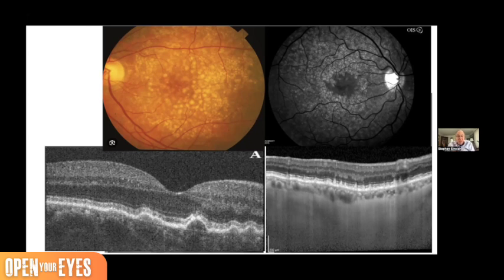Okay. Anyway, just very quickly. So when we take the standard fundus photographs of patients, older patients, and with the exploding population aging, we're seeing a huge increase in macular degeneration. So it begins as these deposits in the outer retina that we call hard and soft, big and small drusen.